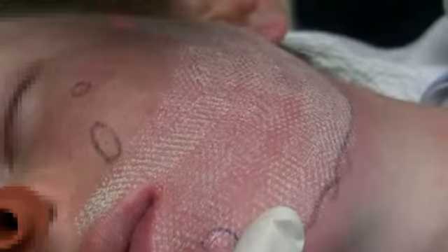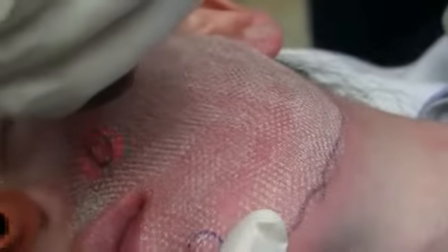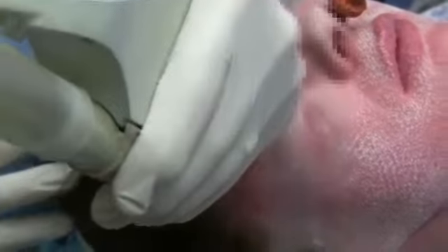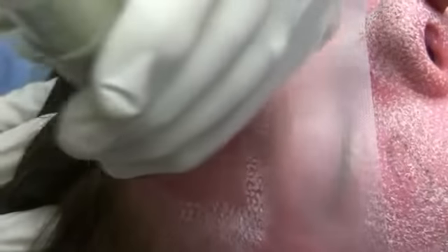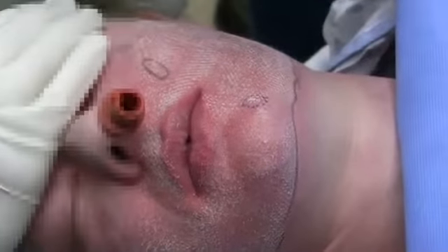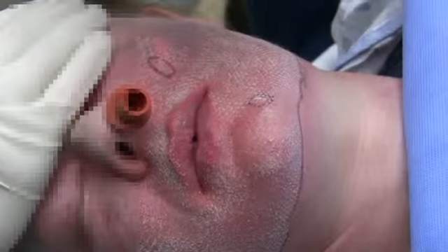I'm going to start. There's a really heavy area here. We'll address face shape, thin lines, remove fine lines, do a couple extra passes over these acne scars, and then we're going to take off that mole.